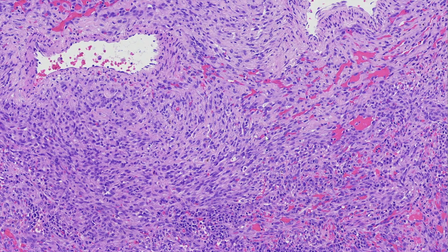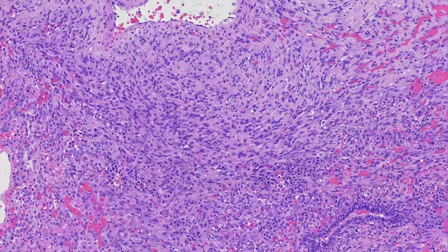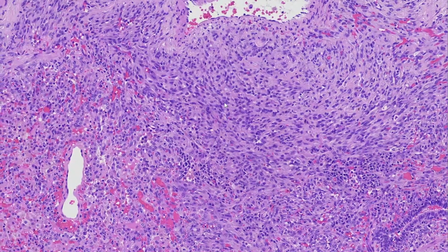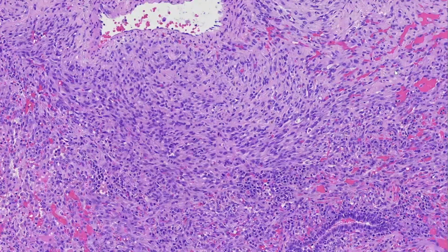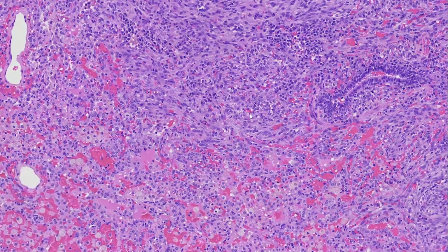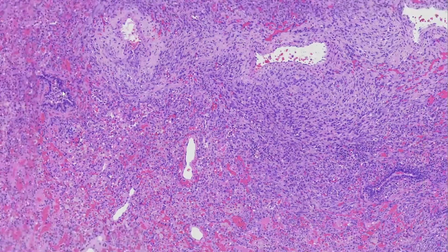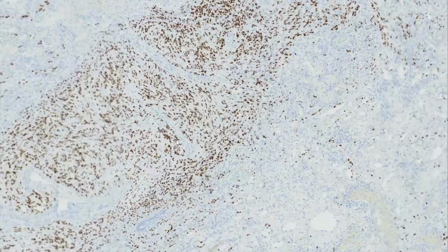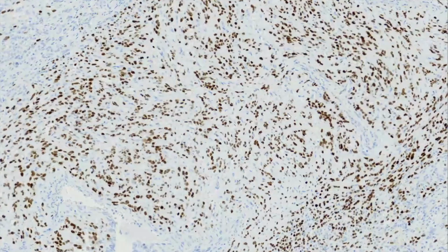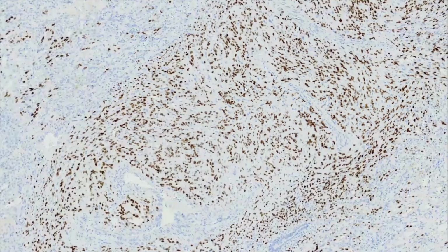And an important vascular lesion in the lung is actually Kaposi sarcoma, which typically has this relatively monotonous proliferation of these spindle cells in fascicles. We see these complex vascular channels. We often see extravasated red blood cells and intracytoplasmic lumina formation. And then we can confirm this diagnosis with an immunohistochemical stain. So this is an immunohistochemical stain for HHV8, which is positive in Kaposi sarcoma. And so these cases are classically associated with HIV, in which they develop, and/or other immunodeficiency states.